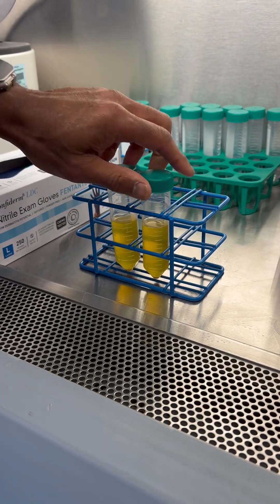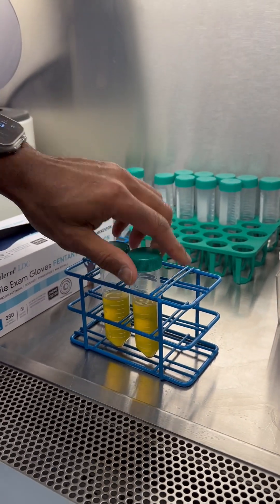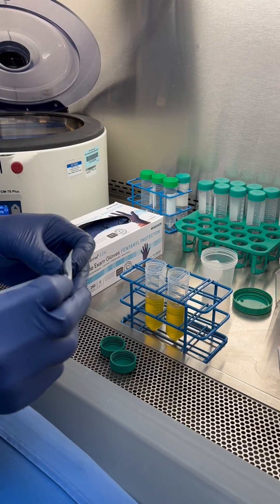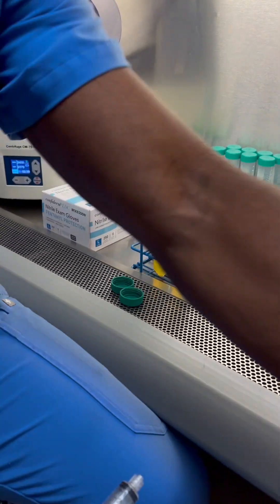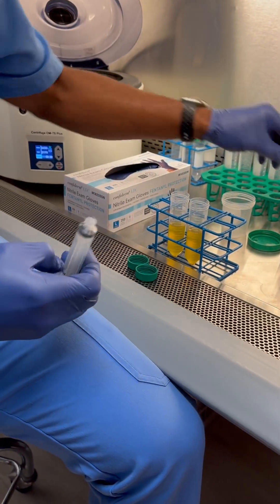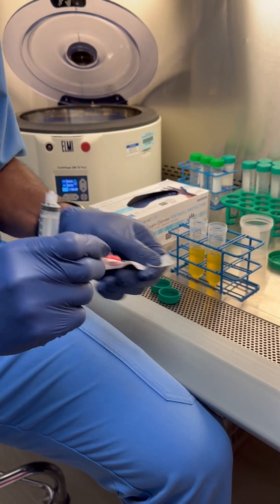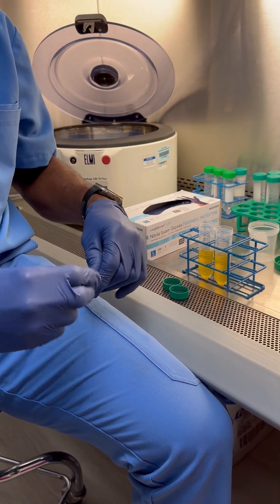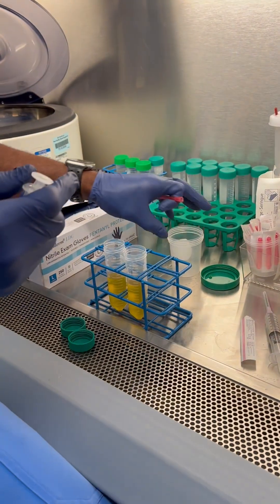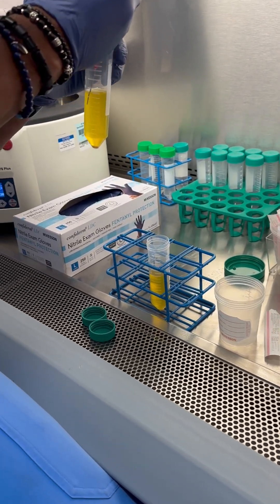This is after the five-minute spin. You can see all the platelets are at the bottom. Now we just have to decide how much plasma we want. Because of the locations we're treating — gluteal tendons and tennis elbow — we're going to make a total of seven cc's of PRP: probably four at the gluteus and three at the elbow. We use this cup, which doesn't need to be sterile, and now we take out all the plasma.